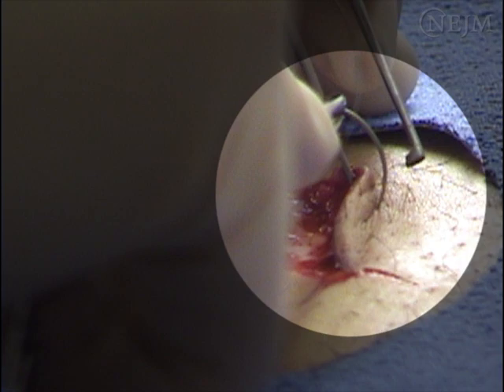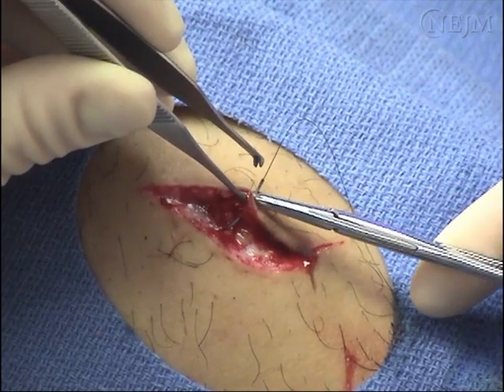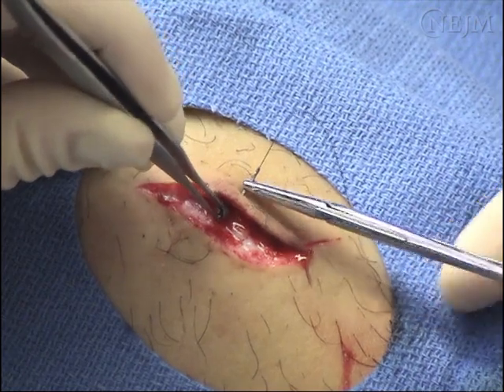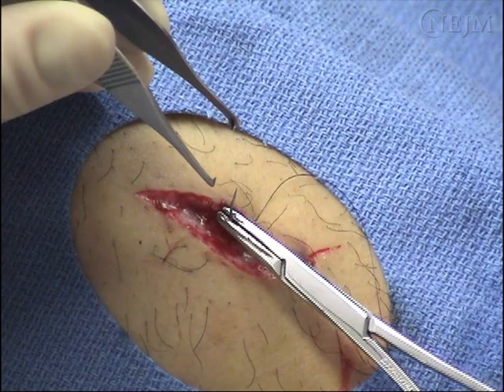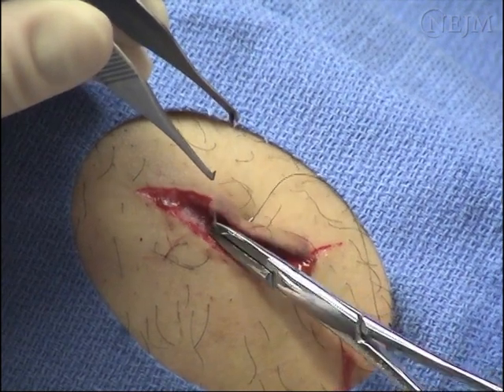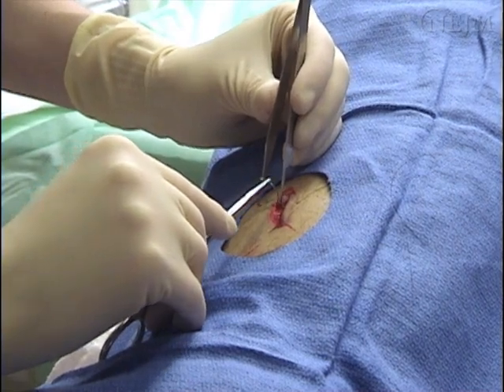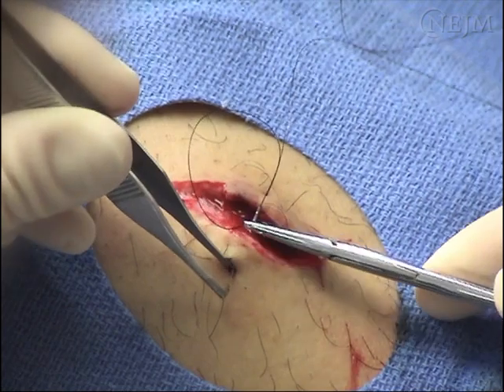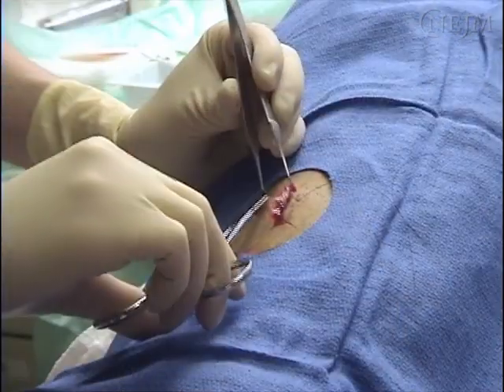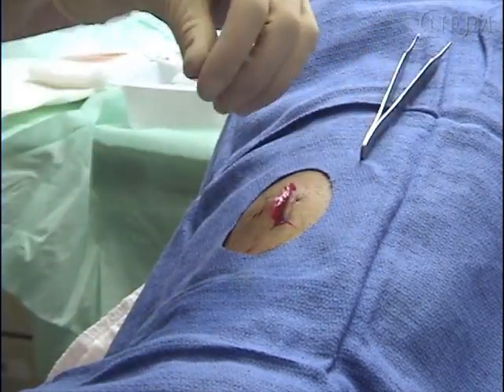Enter the skin at a 90-degree angle and then supinate your wrist to drive the needle through the tissues. Use the forceps and then the needle holder to grasp the needle near its tip, being careful not to crush the actual needle tip before supinating your wrist again to complete the first half of the stitch. Repeat the process on the opposite side of the laceration, first everting the wound edge with the forceps and then driving the needle through the tissues by supinating your wrist. Pull the suture material through the wound so that a 3-centimeter tail remains on the entry side.